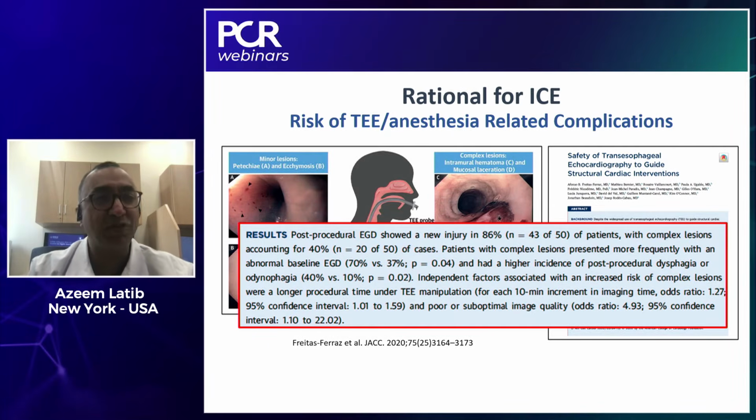That just sounds like a tricuspid procedure by definition, right? Longer procedure time, tricuspid valve further away. So I worry about this in our tricuspid patients, particularly because they also have right-sided failure, congestion, and so this may be a reality that we need to think about.